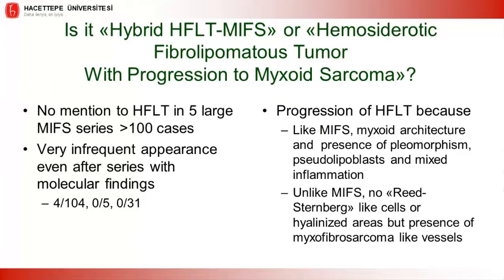This is, of course, a controversial topic, but we can say that lots of large series do not mention any hemosiderotic fibrolipomatous tumor around or surrounding this tumor, and even after the molecular findings, it is seen very infrequently.